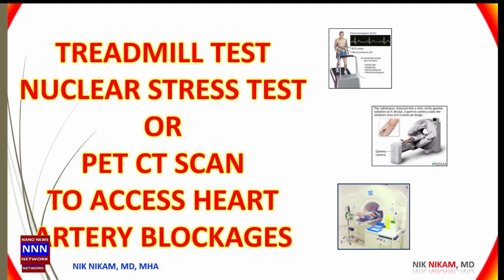Along the same lines, we also have the third category, which is the PET scan, PET CT. The beauty of the PET CT is that the PET CT has a much better resolution compared to the nuclear images, and this can be done using a CT scan which looks at the calcium score, which some of you have heard about. So that CAT scan also looks at the blood circulation in terms of how much blood circulation is improved with medications that we give to dilate the blood vessels.